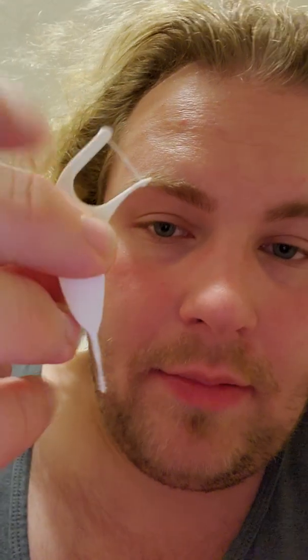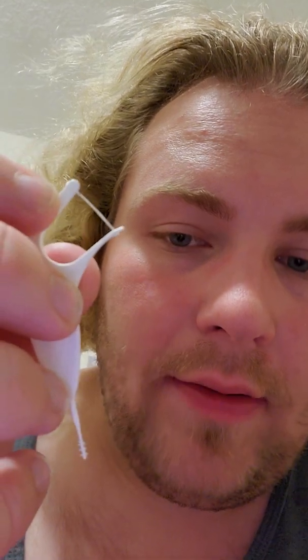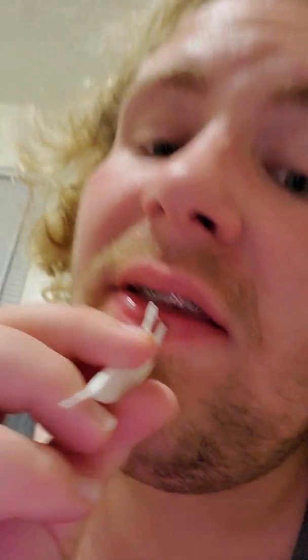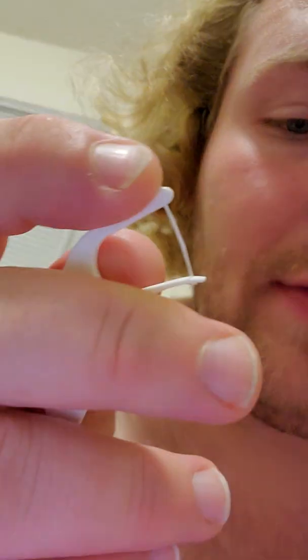The only difference between a flosser and an orthodontic flosser is this is called a platypus, because normally you would have this size on each side. Well, if you're flossing with braces, you don't have room for it to go between your wires. So what you would use is you would put the flatter end towards the braces, and it would get in between that, as this size wouldn't.